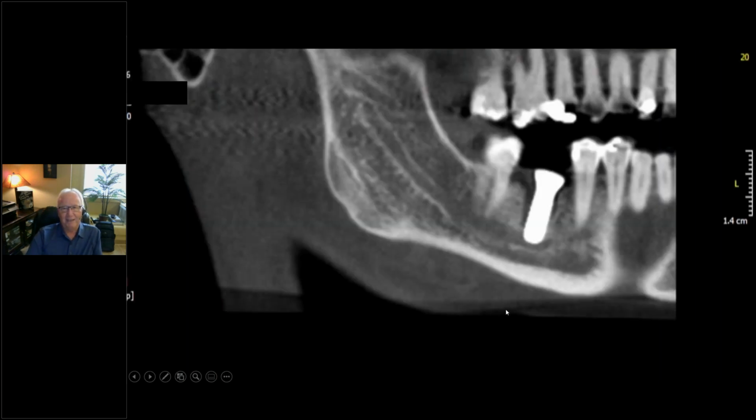Here's a case of an implant in the canal. Well, I don't even need to do sexy imaging to see it in the canal, but some of these canals are not all that detectable in these mandibles. This is a very old scan, probably 12 or 15 years old, one of my first cases. And this is one of the ones I used the endoscopy tool on because someone asked, would I see an implant in the canal if I use the endoscopy tool? I said, yeah, I just don't have one. Well, 2 weeks later, I found one. And I didn't need the endoscopy tool.